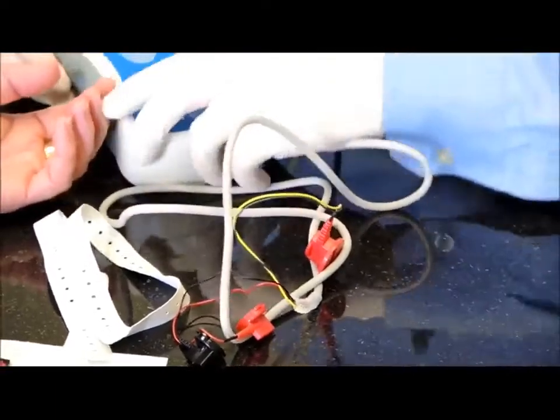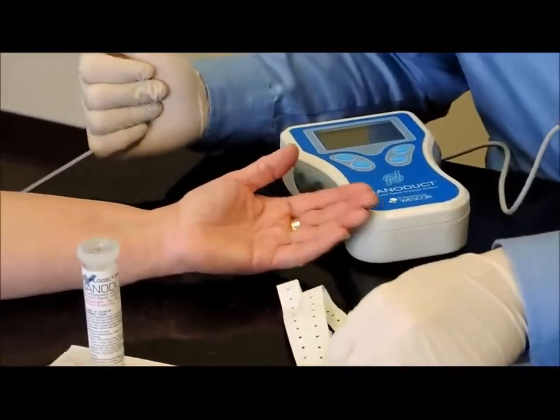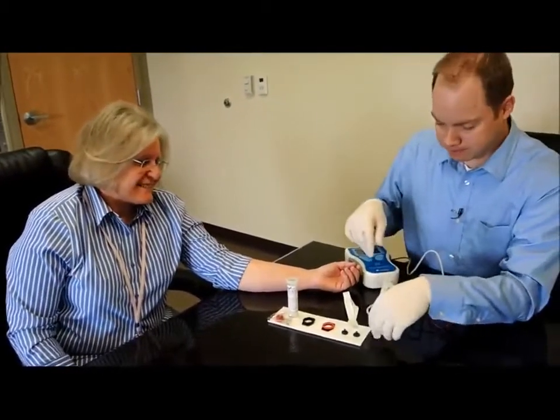So now we have a nice patient. This is Patty Nielsen, for those of you who talk to Patty on the phone or on emails. She's our subject today. So she's going to be our patient. We're using the medium-sized straps.